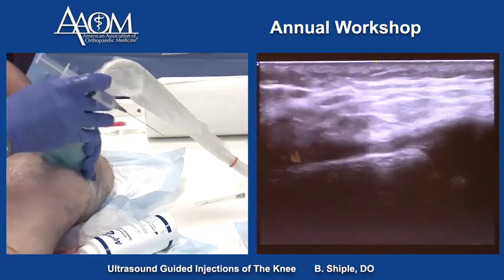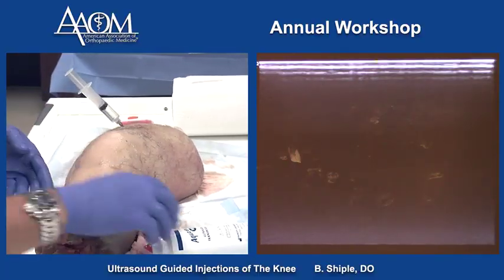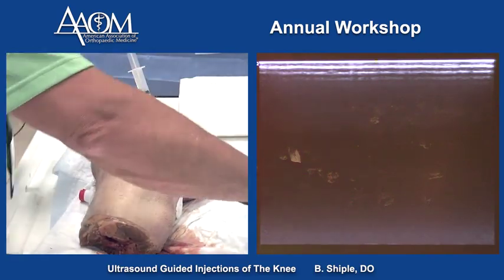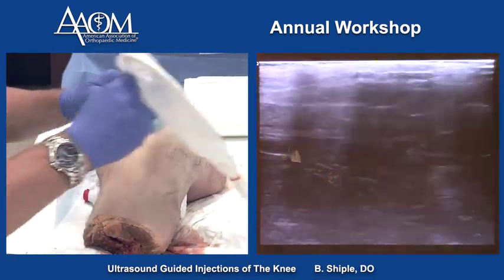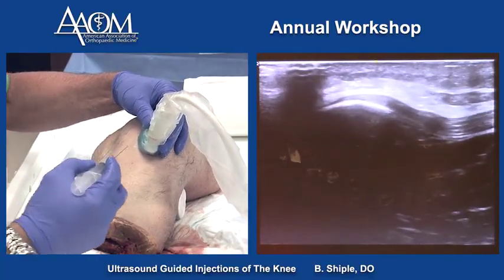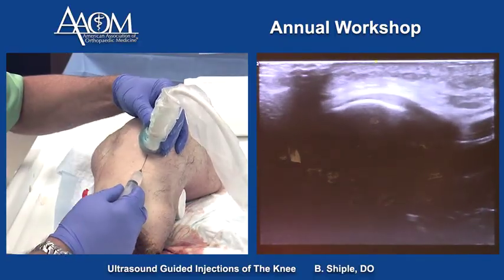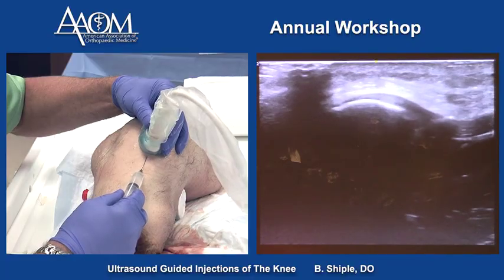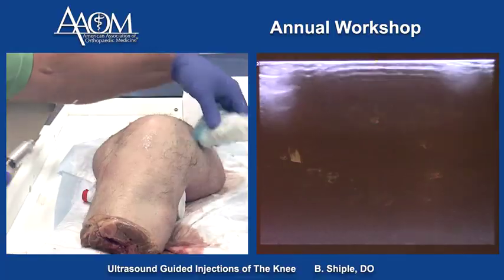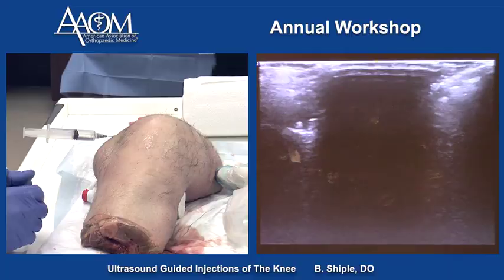The last one we'll do is the patellar tendon. We put the patient's leg in flexion and use a long axis technique. The needle tip is in the tendon right there. That covers most of the targets in the anterior, medial, and lateral knee.